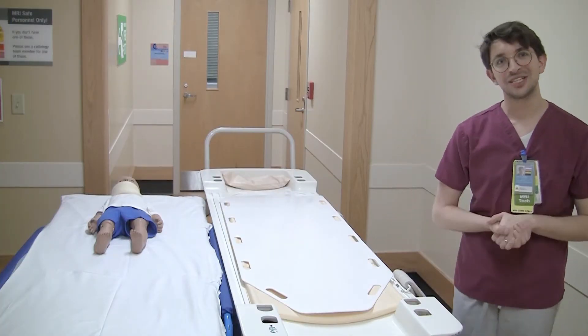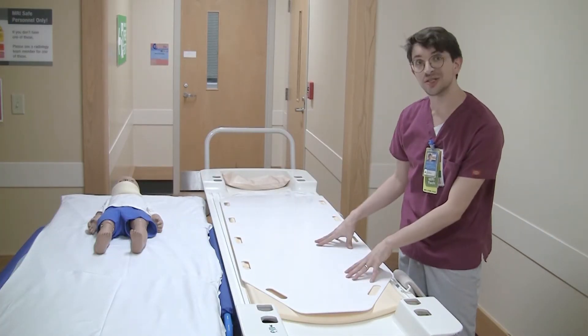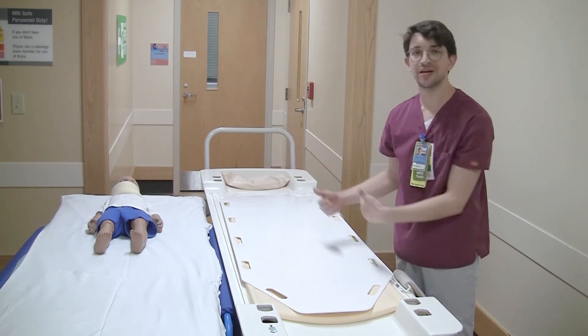Hi, my name is Tony and today I'm going to teach you about using the slider transfer board to safely transfer a patient from one bed to the other.